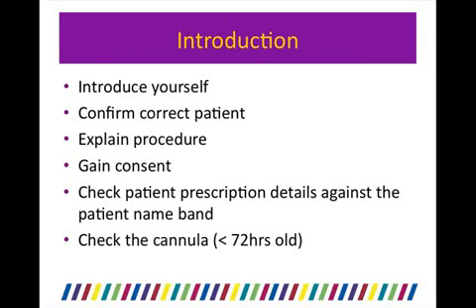Begin by introducing yourself with your full name and title and confirm you've got the correct patient by checking their name and date of birth. Explain the procedure to the patient and gain their consent. Check the patient prescription details against the patient's name band and check that they have a cannula in and that it is less than 3 days old.